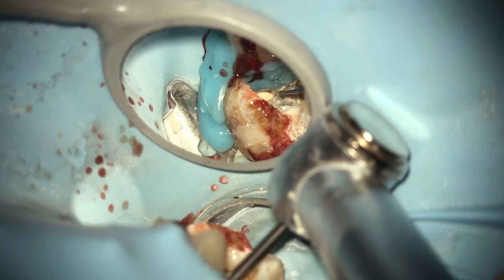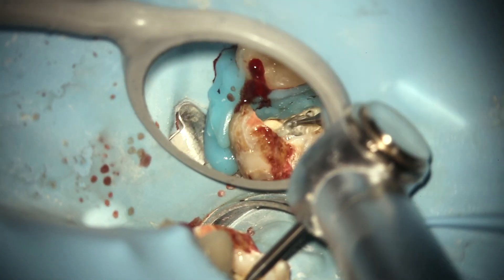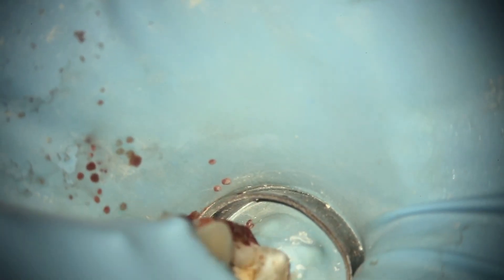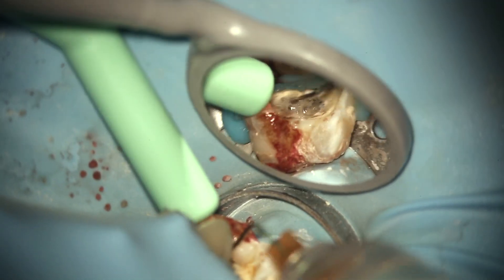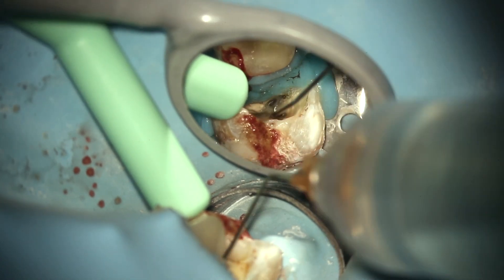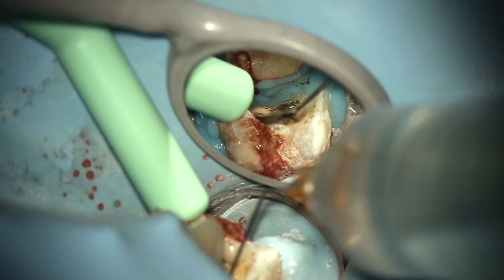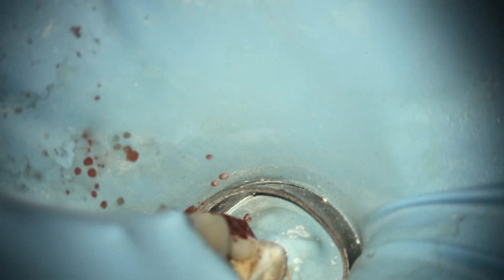I already uncovered the MB2 — it's right there. Obviously it's not always that easy; I struggle, there are days when I need to go back to residency. I will have a later book called Advanced Root Canals for when it doesn't come out this nicely. This book covers simple to medium-difficulty root canals — a great place to start, master those, then progress to black-belt advanced hard cases.